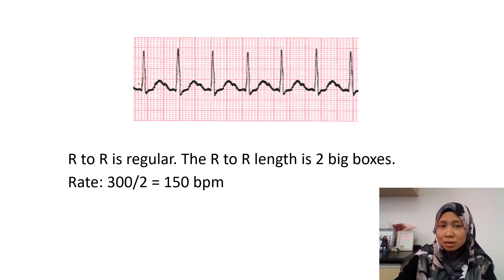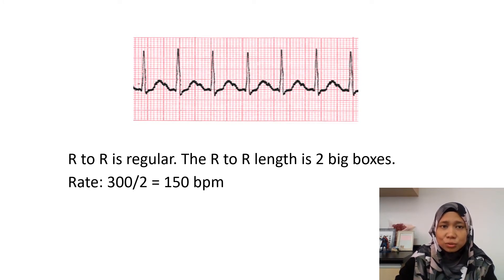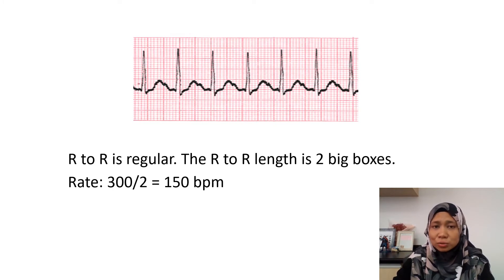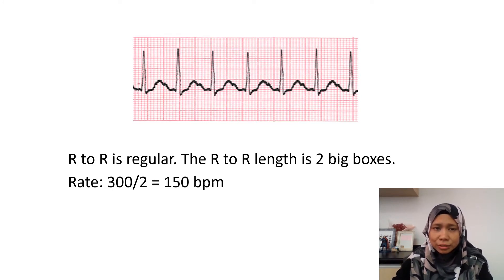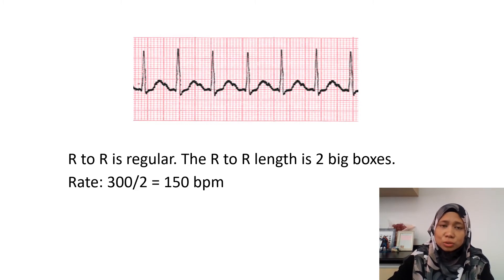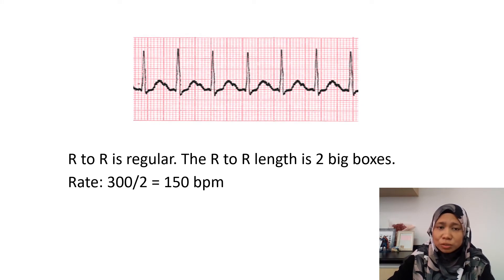Looking at this ECG strip, the RR interval is regular — the duration from one R to the next R and from that R to another R is the same. The R-to-R length is about two big boxes. So the rate is 300 divided by 2, which equals 150. In 300 big boxes we would expect to see 150 R waves, giving us 150 beats per minute.